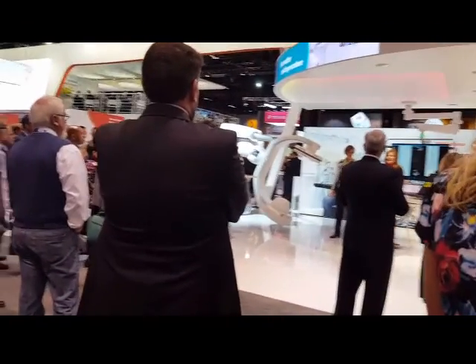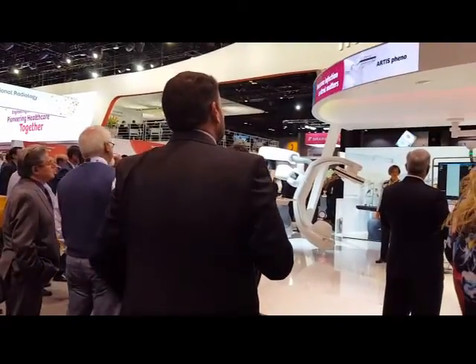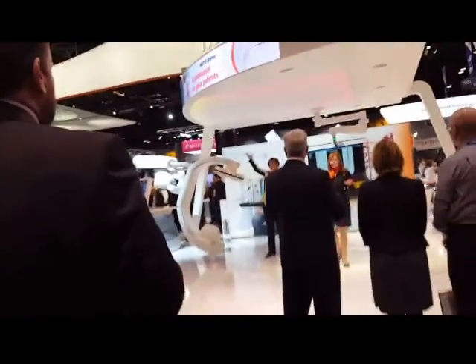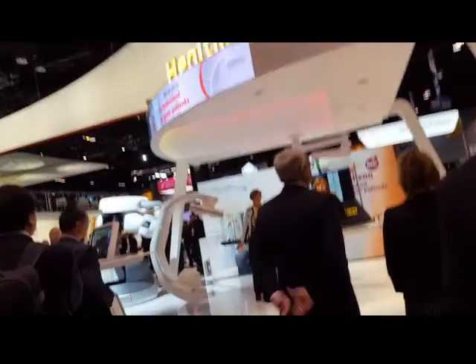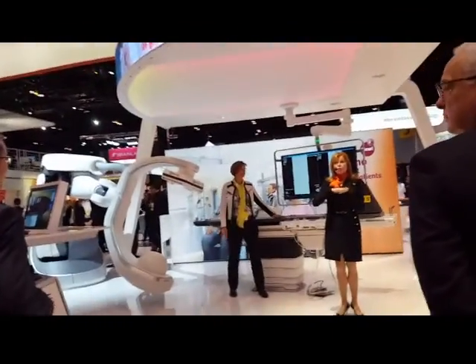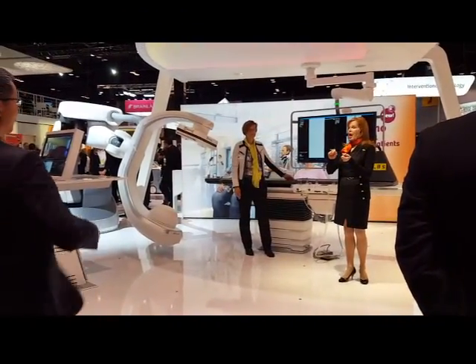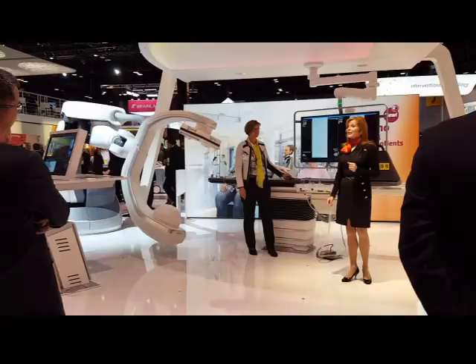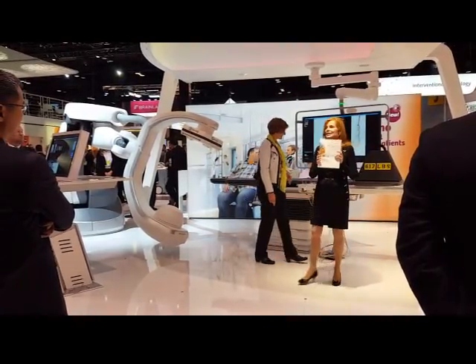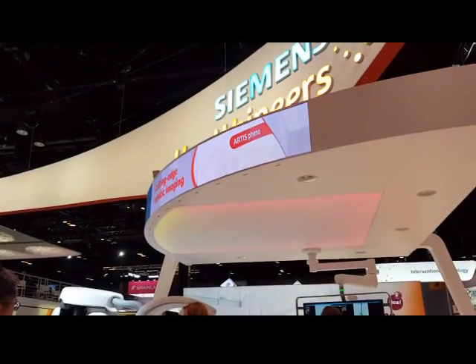They're doing a demo right now for a C-arm system that helps reduce infection. I'm not sure how that happens, but let's listen for a little bit. The cables are routing inside the system, and it features an antimicrobial coating to protect from viruses and bacteria from spreading. A lot of people have asked how to properly clean the system, which detergents to use, and how to achieve reliable results. Siemens, together with their partner Ecolab, has developed CleanGuide.